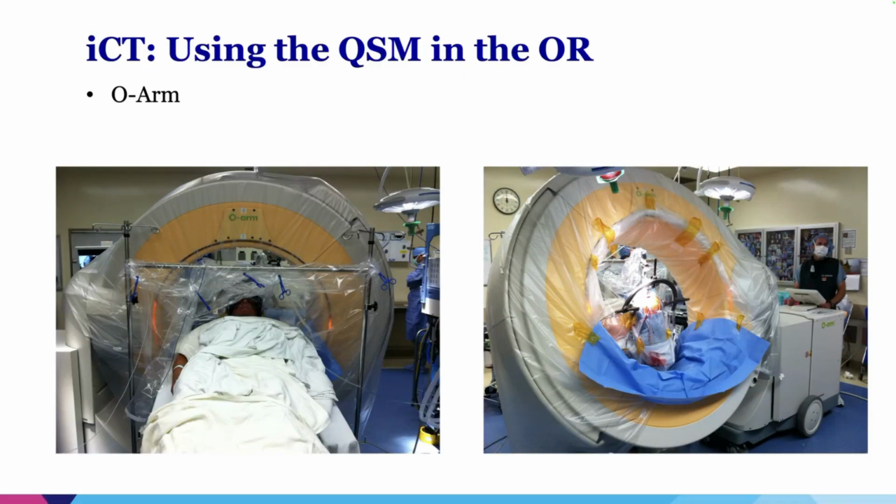I like to use intraoperative CT scan. I've done a number of MRI cases. Look, I think a tool is a tool. I personally never liked working in the MRI suite. I found it to be cumbersome. It took longer. It didn't really necessarily help me in any way.